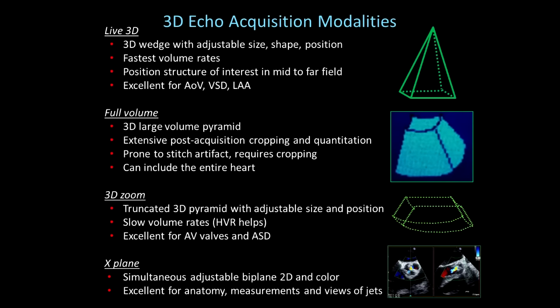Live 3D imaging involves a 3D wedge with adjustable size, shape, and position. The user defines those settings and it's very important to optimize them. In general, it has the fastest volume rate. It's important to position the structure of interest in the mid to far field where the sector is the largest. Live 3D works very well for the aortic valve, ventricular septal defects, and the left atrial appendage.